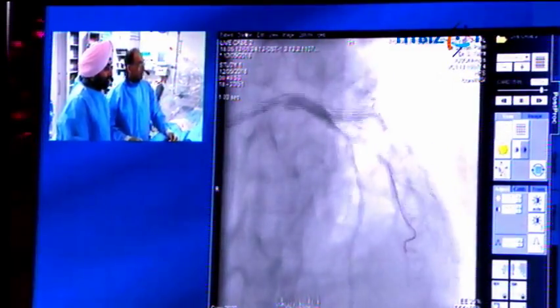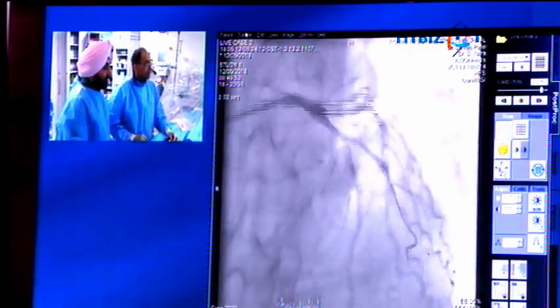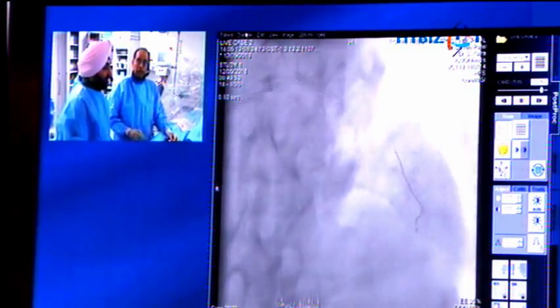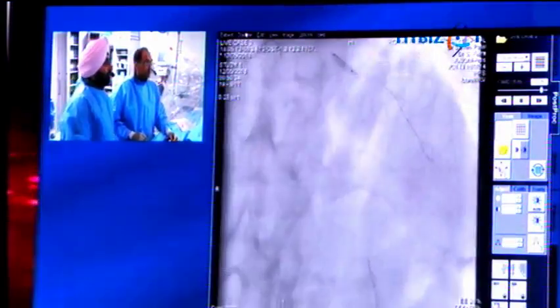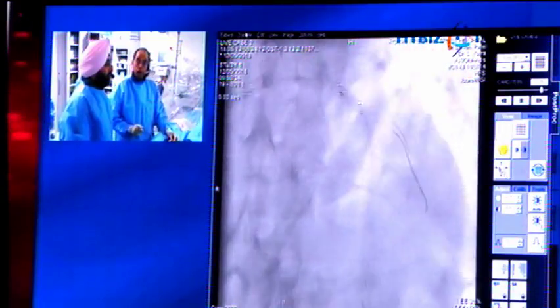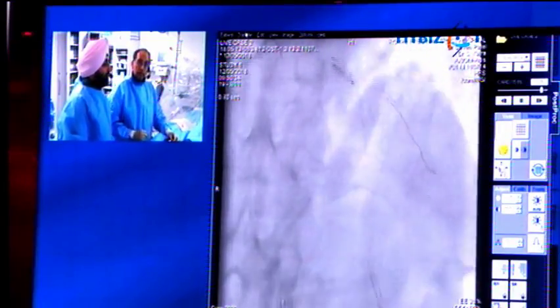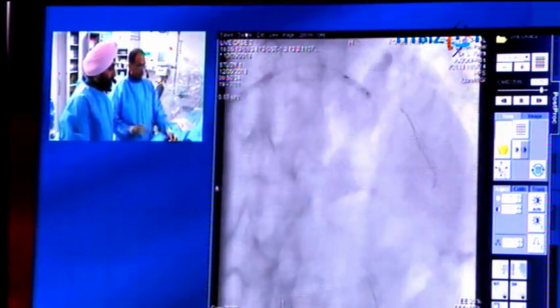Yeah, thank you. So this is after dilatation. The patient had quite marked elevation. He was pretty symptomatic at this point. We decided to go directly to stenting rather than do any more OCT. Next shot, please. We decided to go for a Sierra stent. The OCT was very helpful in deciding on distal sizing. The distal reference was around 3 millimeters, and therefore... So yeah, if we can switch to the OCT now.